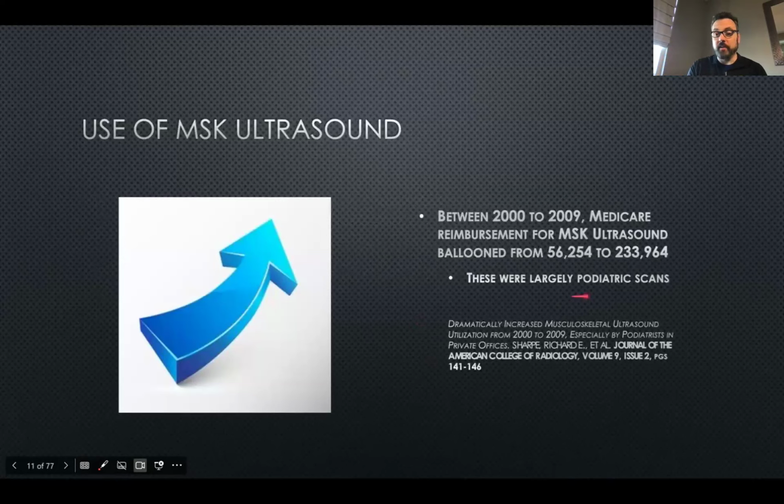In terms of its usage, this is the big thing that I've seen. I'm in the Chicagoland area, and what we've seen around the Chicagoland area is that it's big in podiatric medicine. It's huge. That's probably made the biggest leap. It's also big in our profession as chiropractors. I can think of a number of chiropractic schools that feature musculoskeletal ultrasound. I learned it at National. I think the first big school to really incorporate it formally was Logan, but I know Palmer and Davenport have it. I know it's out in the Pacific Northwest. So all the chiropractic schools, at least my colleagues, DACBRs, a lot of us have the RMSK certification because it is becoming more and more prevalent.